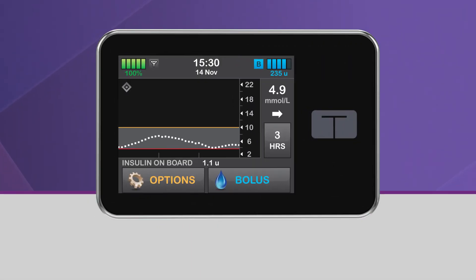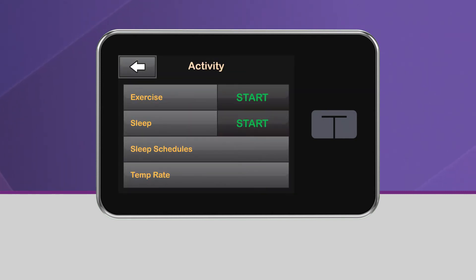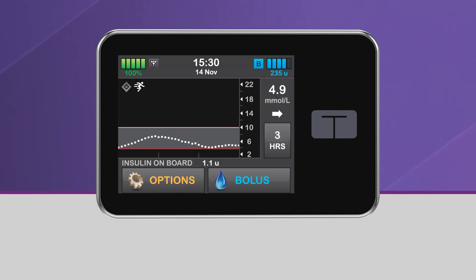To activate exercise from the home screen, tap Options and select Activity. Then tap Start, which is located next to Exercise. You will see a screen confirming that exercise has been activated, and then be taken back to the home screen. On the home screen, you will see the Exercise icon in the upper left-hand corner of the CGM graph.